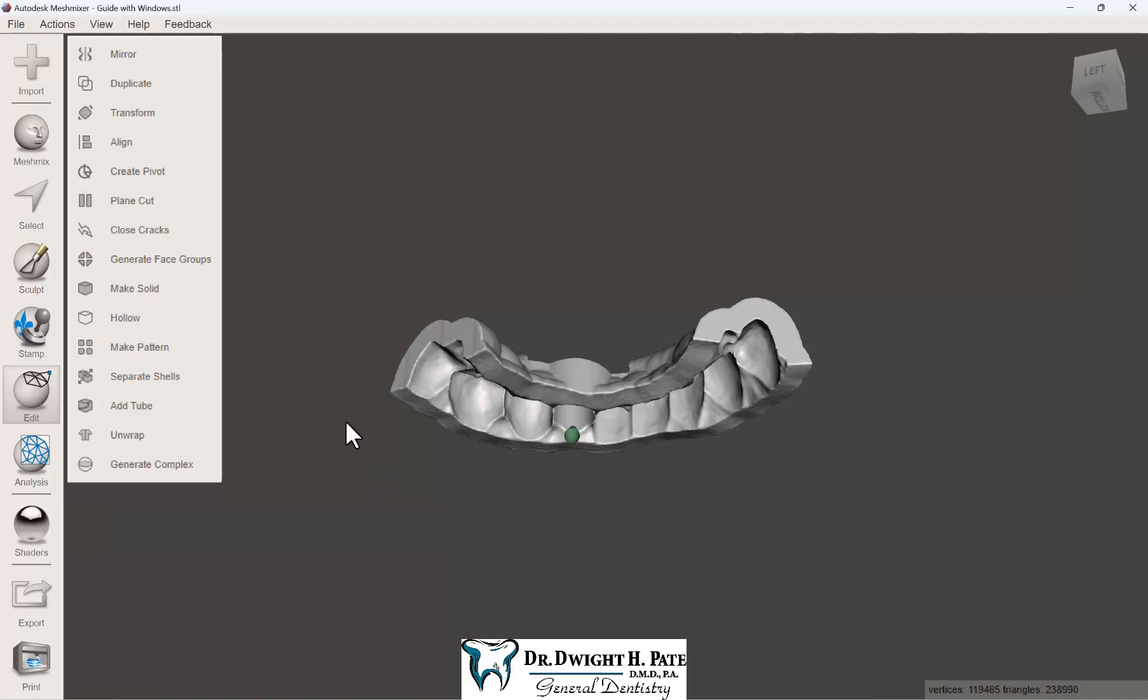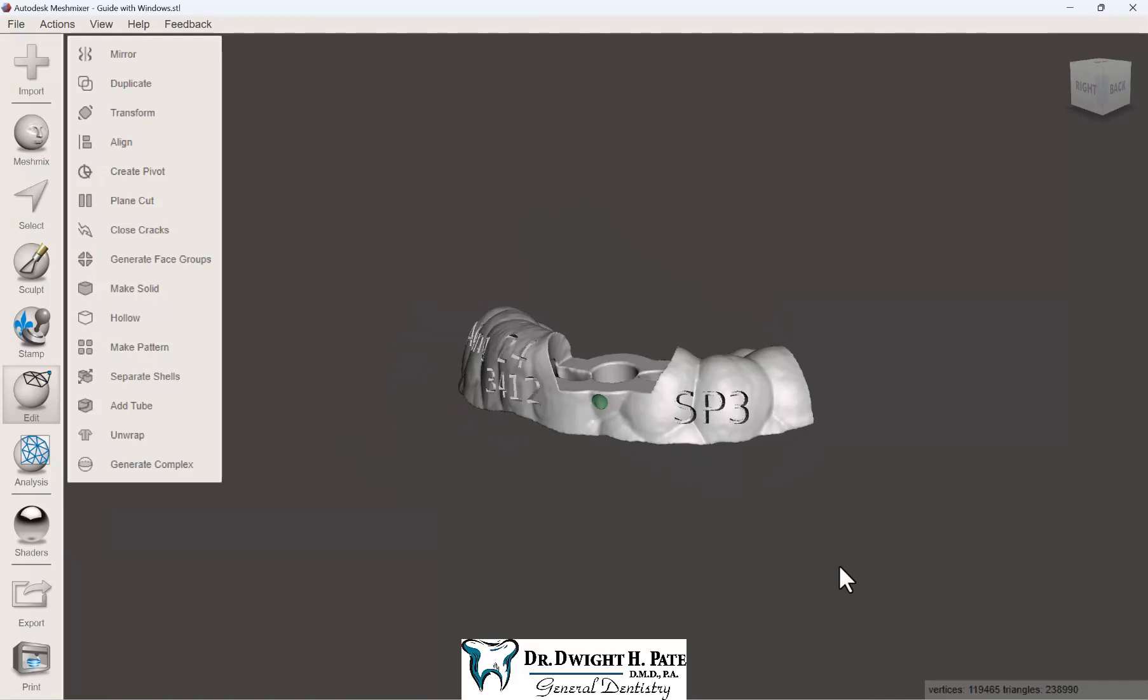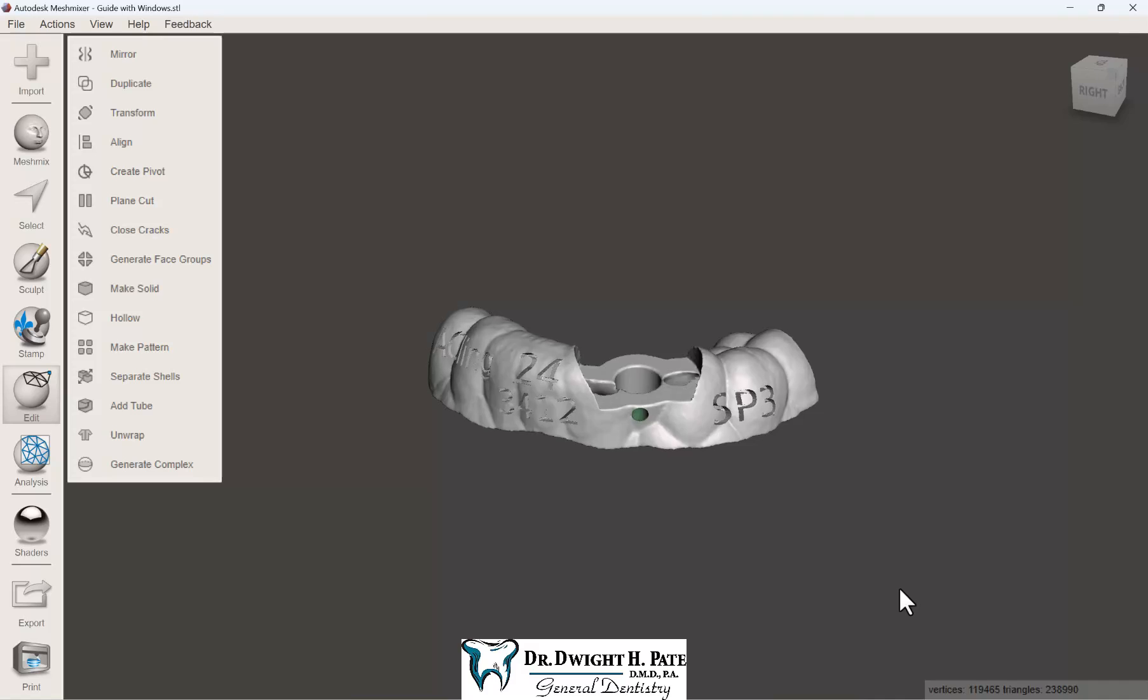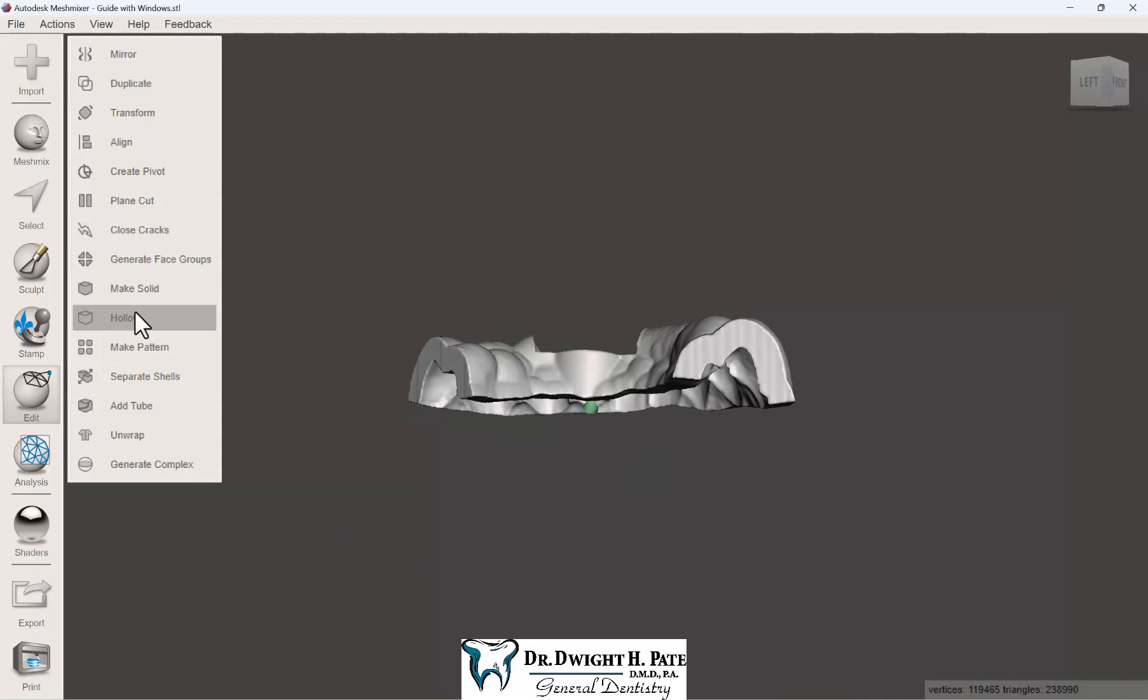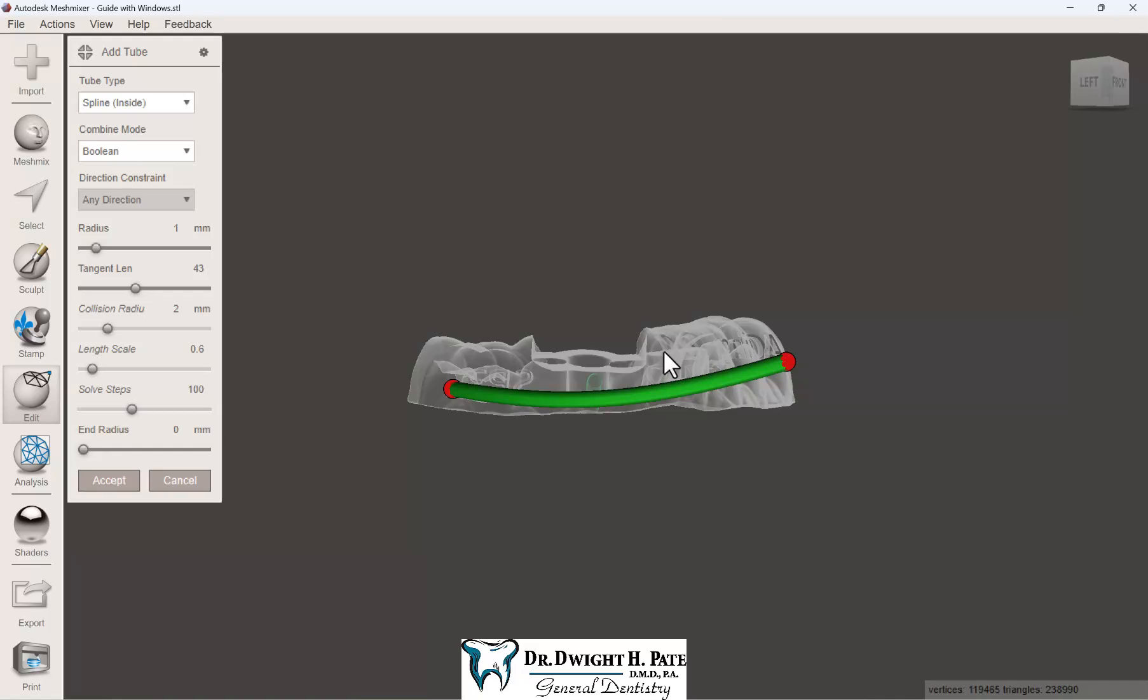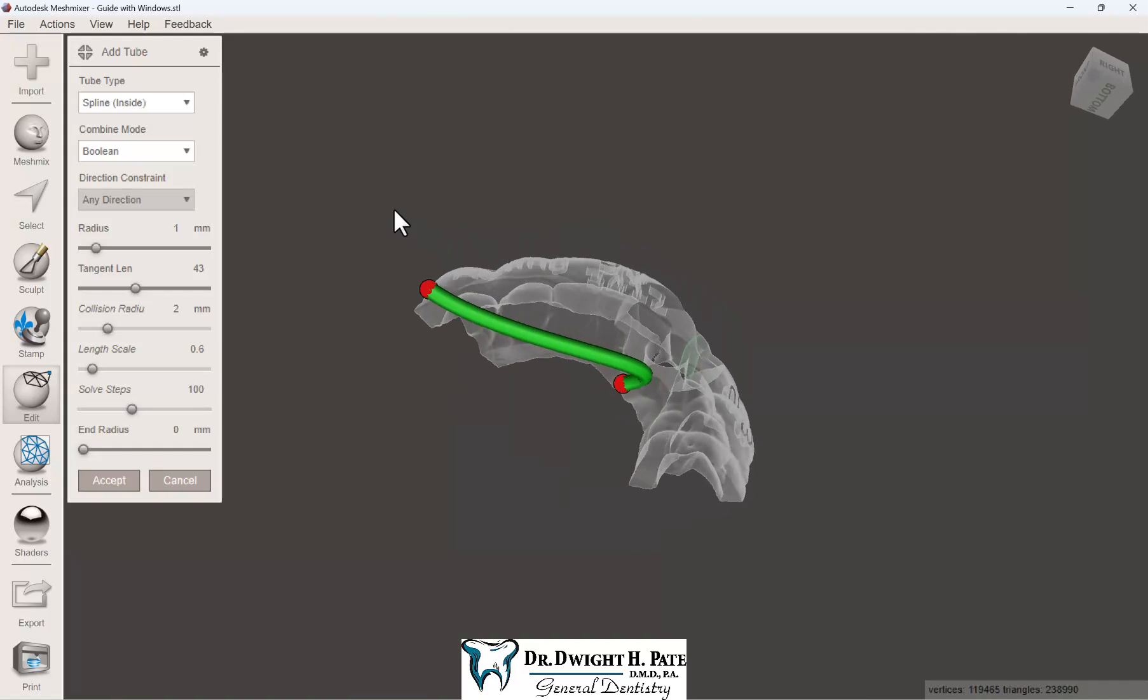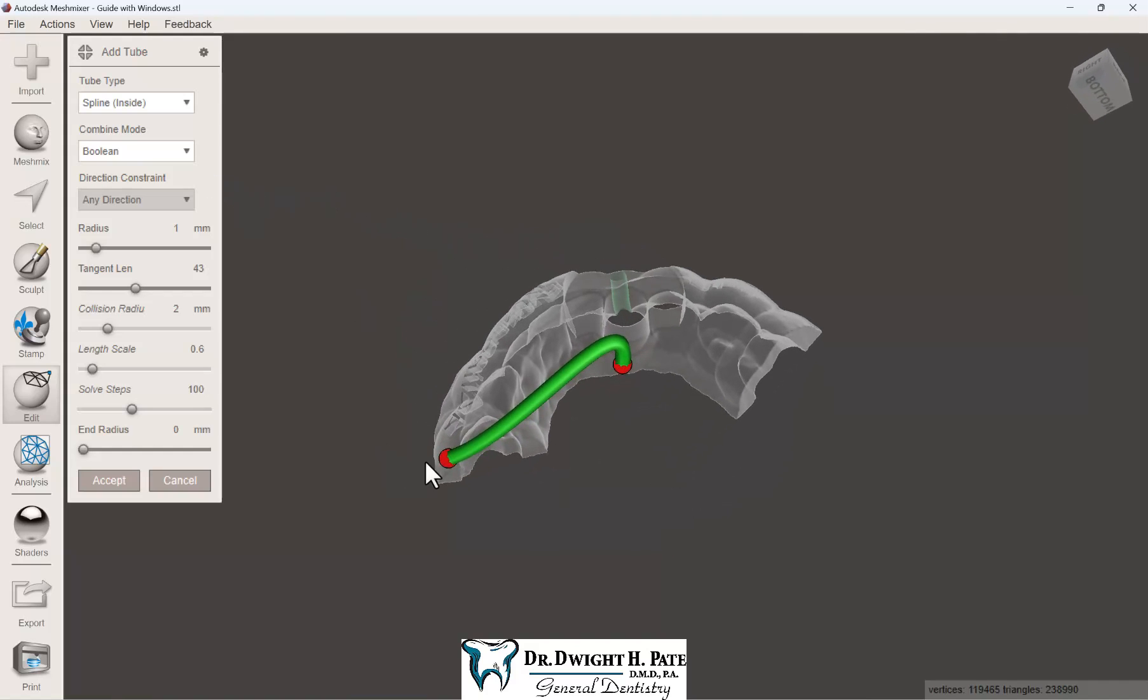You can push cold sterile saline through here, and it will be very effective at helping to cool the bone. With external irrigation, a lot of the water is blocked from getting to the actual osteotomy site.